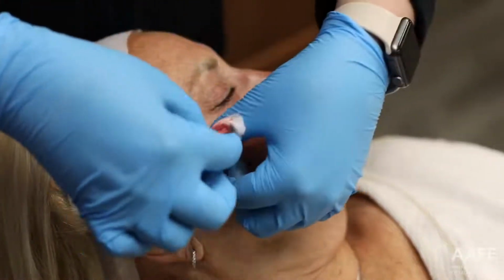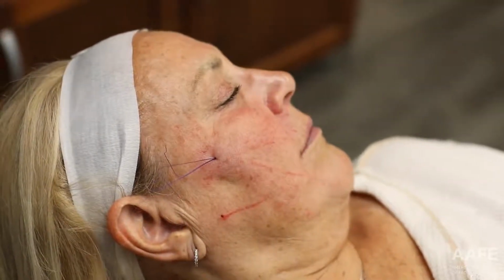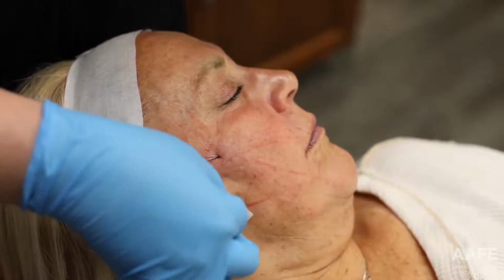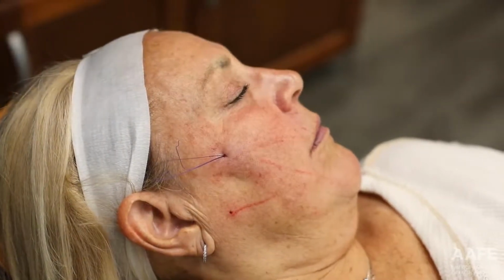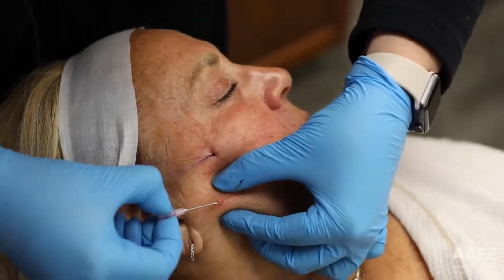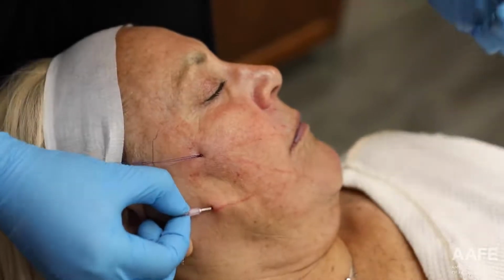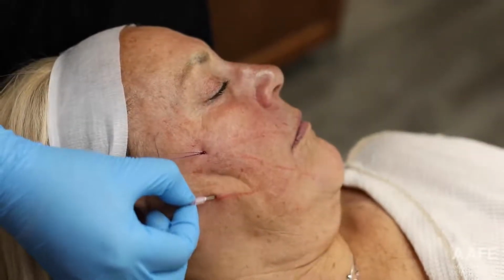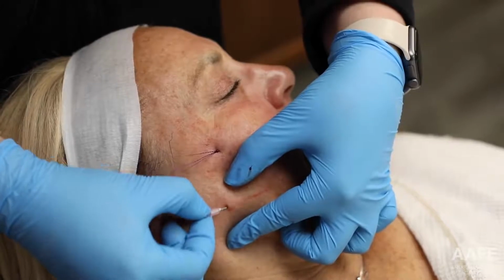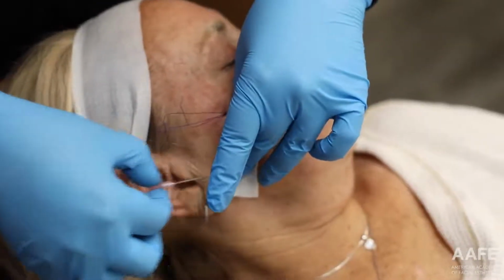Okay, so typically what I like to do is leave these 3 alone, do her jawline, and then I'm gonna sit her up and see what kind of result I got and see if I want to add any more threads. So I can fit 4 into 1 entry point. So this one only has 3 right now, so I could potentially add 1 more if I wanted. A little bit of pressure, Terry. Good. And then the jawline, I could actually put 4 threads in there. Usually, I don't think she's really gonna need 4 in there, maybe 2, but I don't think she'll need 4.